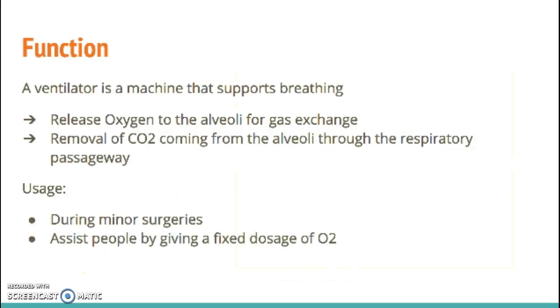So basically, the function of a ventilator is to support breathing, but more importantly, to release oxygen to the alveoli for gas exchange, and to remove CO2 coming from the alveoli through the respiratory passageway. This is used during surgeries or if people need assistance in breathing.